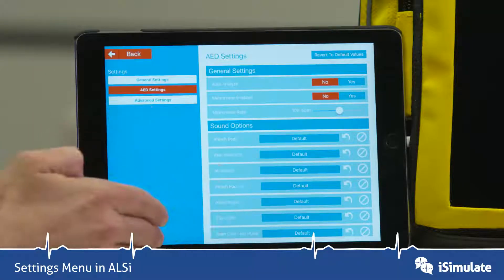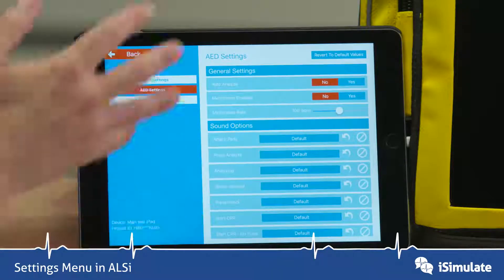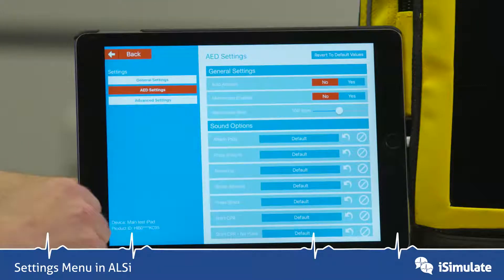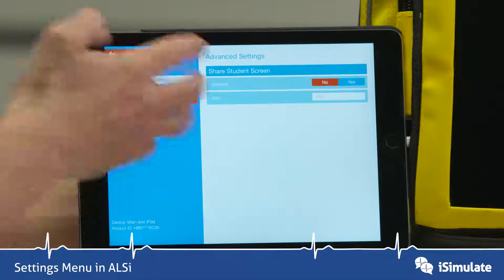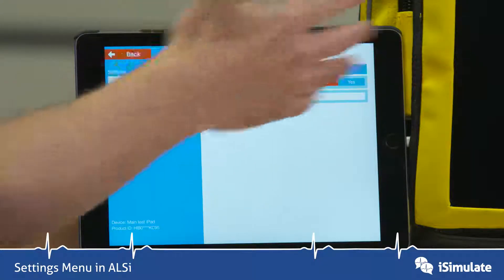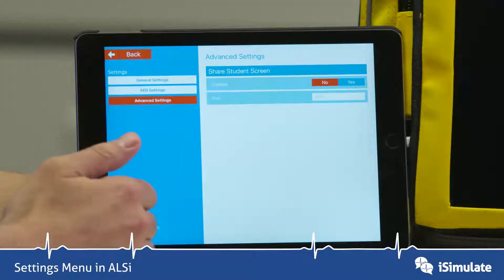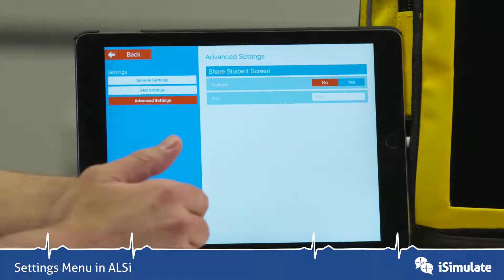The AED settings are very extensive and we'll cover those later. There are also Advanced Settings, which allow you to share the student screen with other simulation recording software.